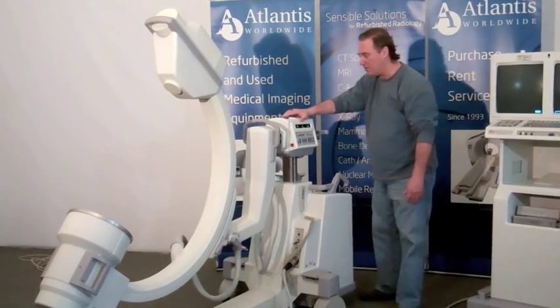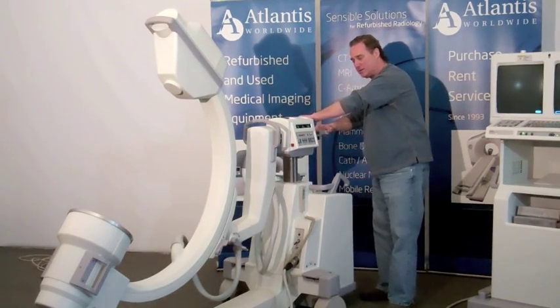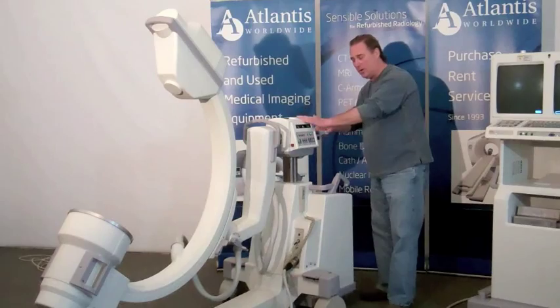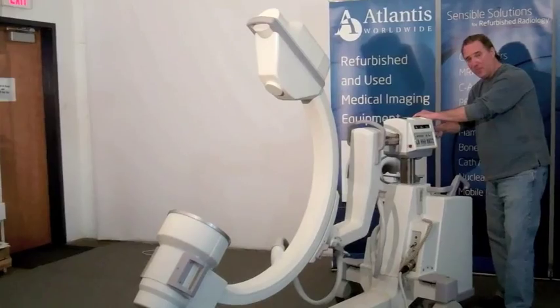The final adjustment is to open up this back lever by the top of the side, which is called the doghouse. You can pull the C-arm in and out with that type of motion.